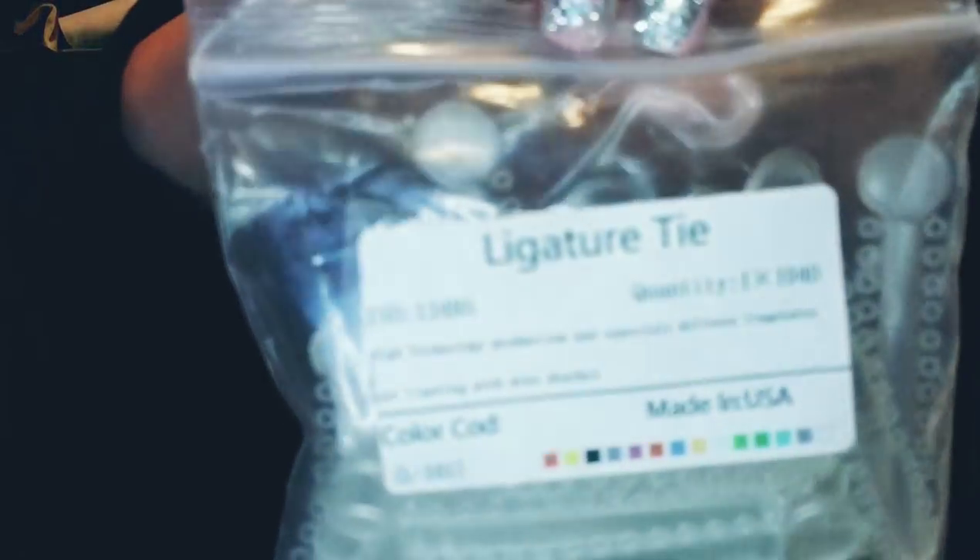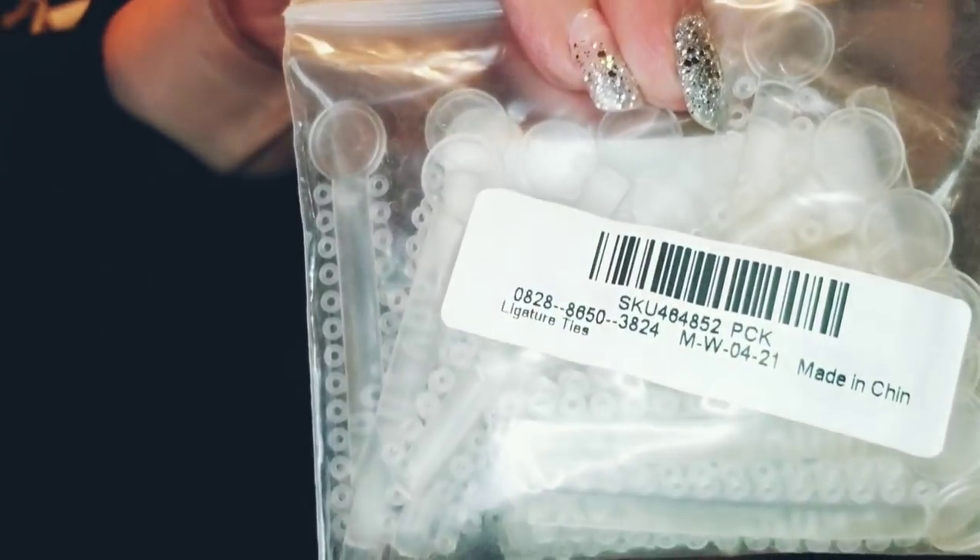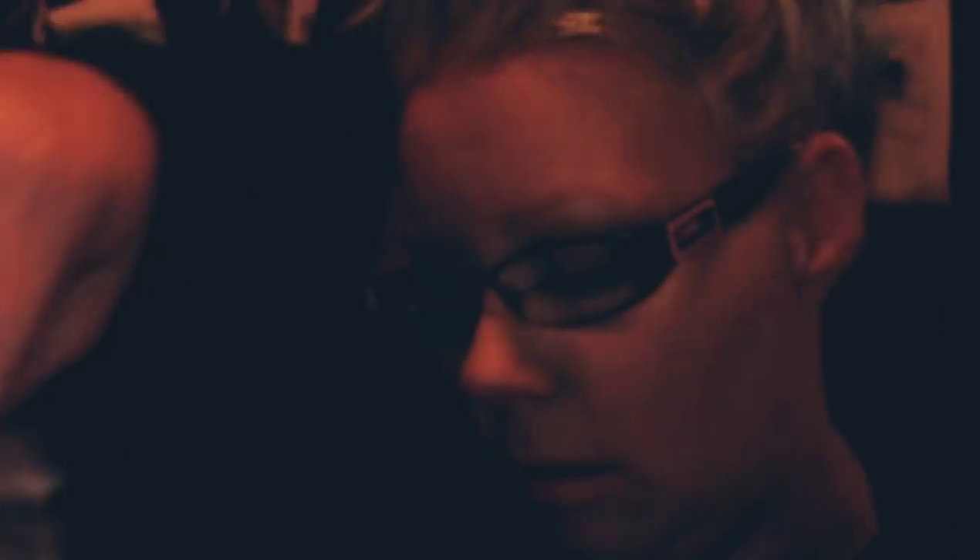You can see they're actually pink — I get them off Amazon. They come in packs of way too many that you'll ever use. I also have them in clear in a big pack — just get them on Amazon.